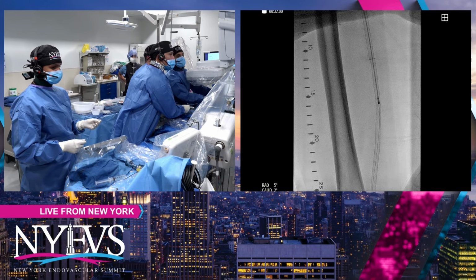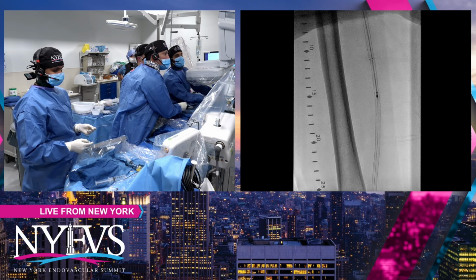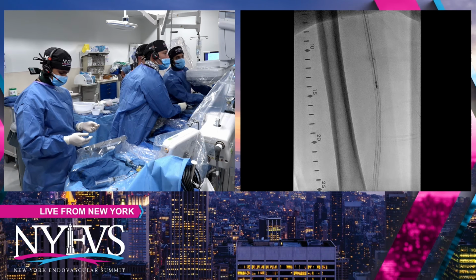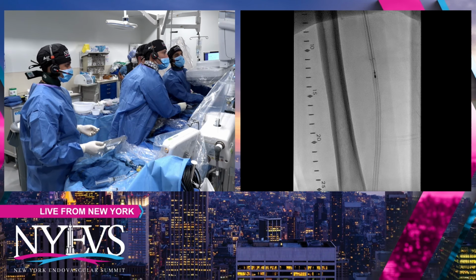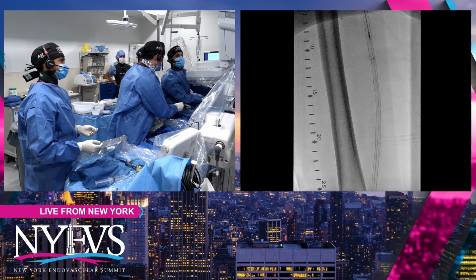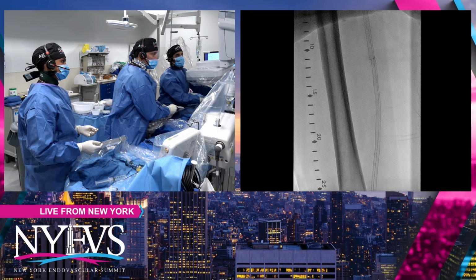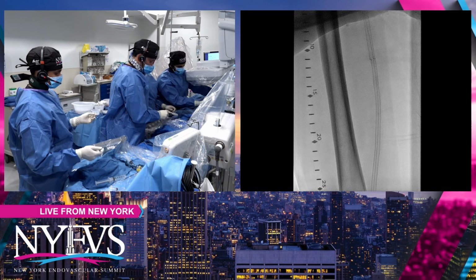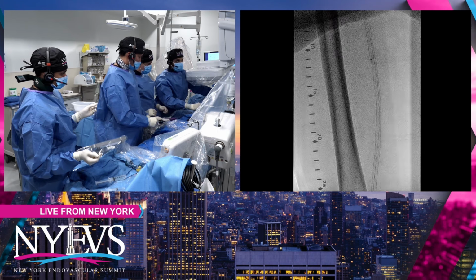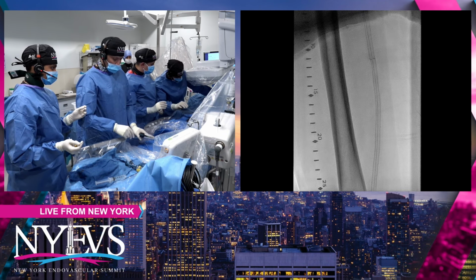How much proximal landing zone do you have on the top? Because if you don't have sufficient proximal landing zone, running a PQ could be a problem. That's been one of the modes of failure, and screen failures for the trial. It would only be within the actual stent, and there is almost a centimeter and a half of native vessel proximally just before the profunda and SFA bifurcation. So it would definitely have to be within the stent.